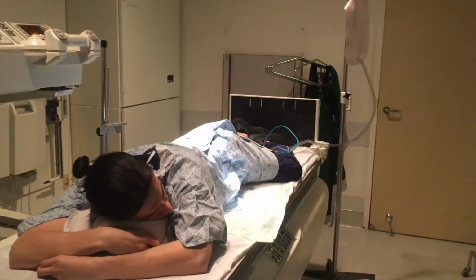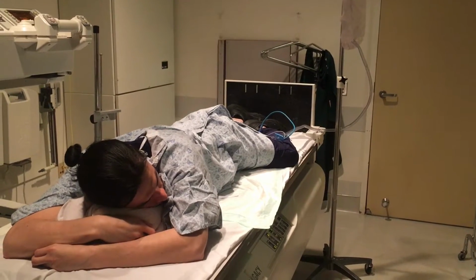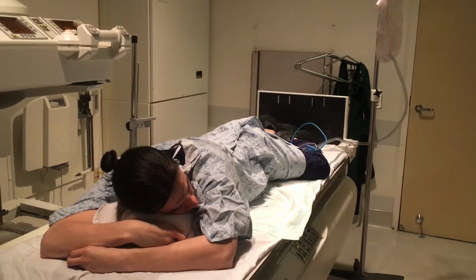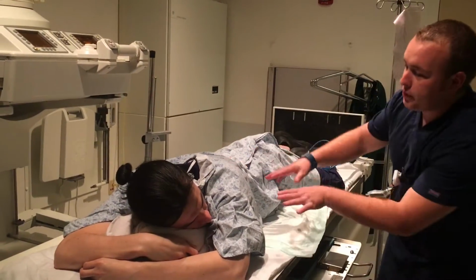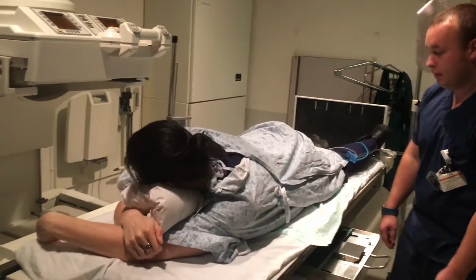Alright. Taking a deep breath. Blow out. Hold. X-ray. Breathe. Alright, go ahead and same position but opposite side. We're going to do the LAO.